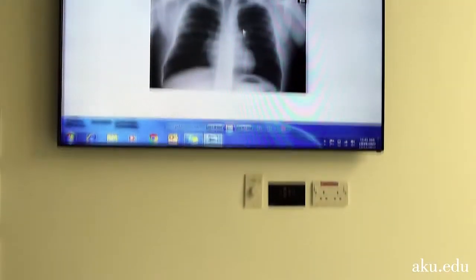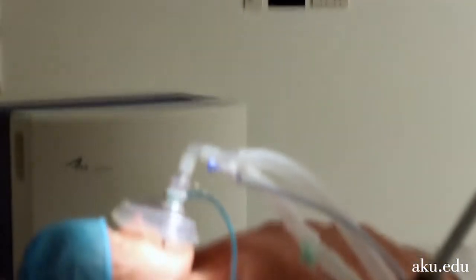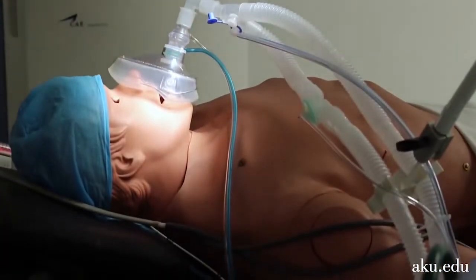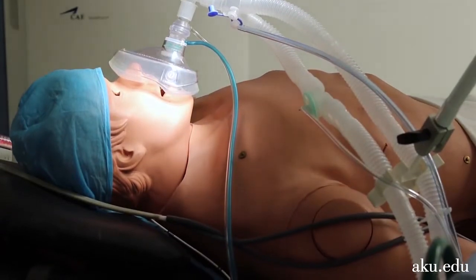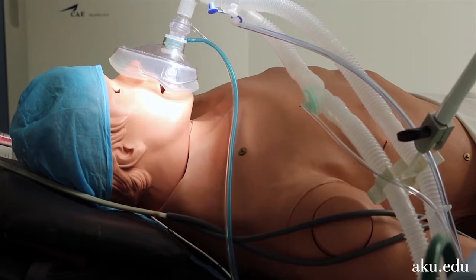Once the simulation scenario is complete, participants watch the recording with a facilitator to get feedback and discuss learning opportunities. The HPS accurately mimics medical conditions and responds automatically to clinical interventions, much like a real patient.